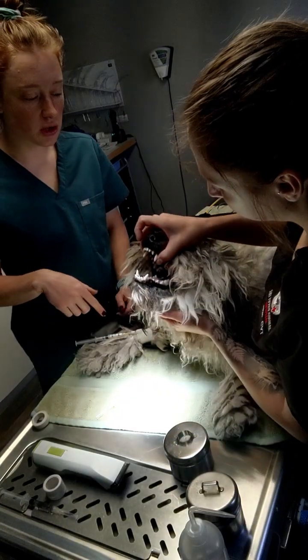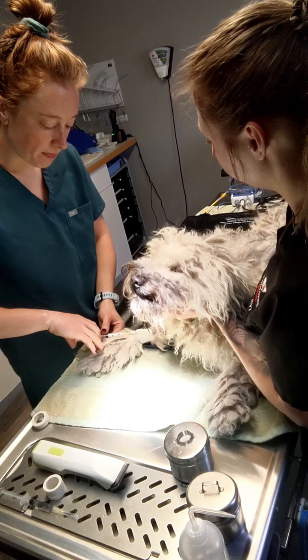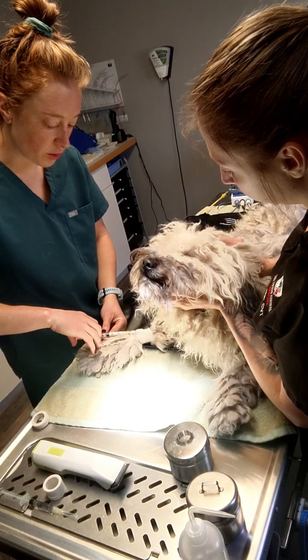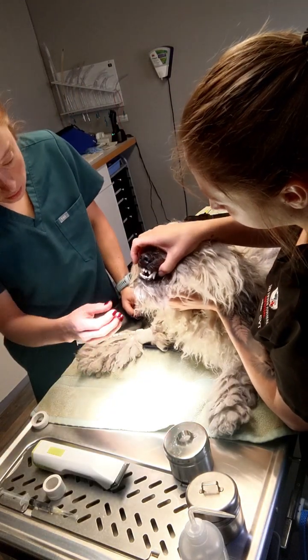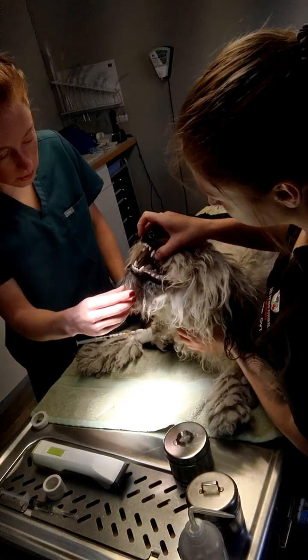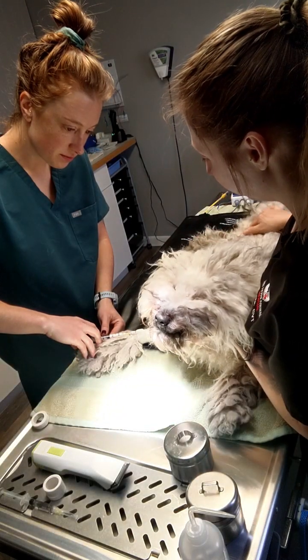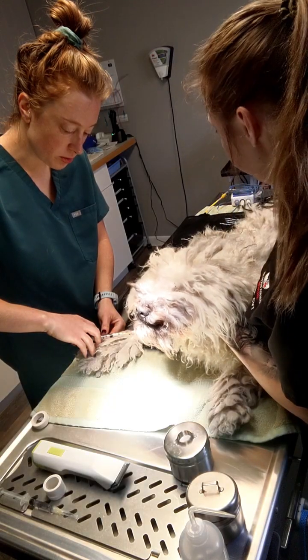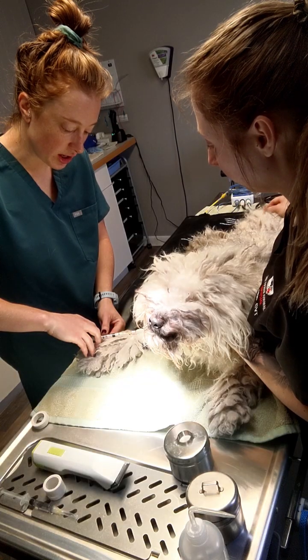So we're looking at jaw tone, we're looking at palpebral reflex, because we want to make sure that she is induced enough in order for us to be able to intubate and start anesthesia. Fighting back a little bit. So I'm going to do about another mil slowly and check again.